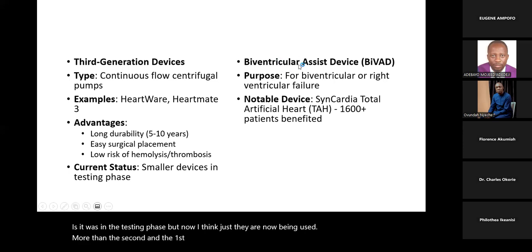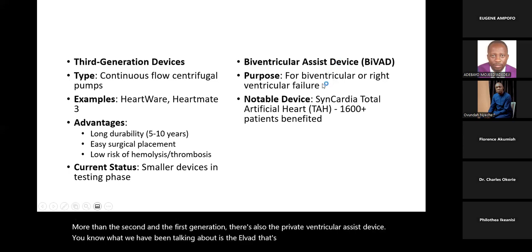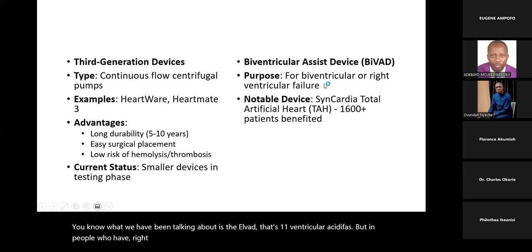There's also the biventricular assist device. What we have been talking about is the LVAD, the left ventricular assist device. But people who have right ventricular failure don't only need an LVAD. They will need a BiVAD, which is a biventricular assist device. An example is the SynCardia total artificial heart.